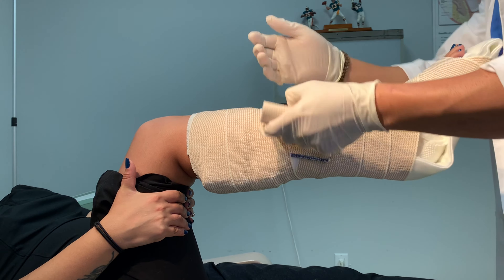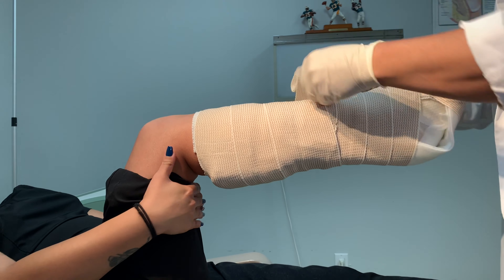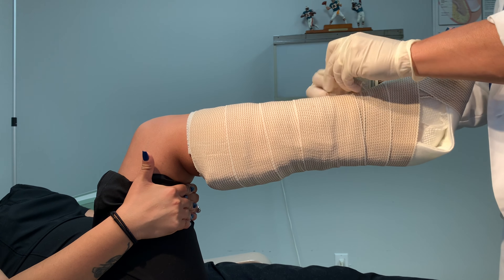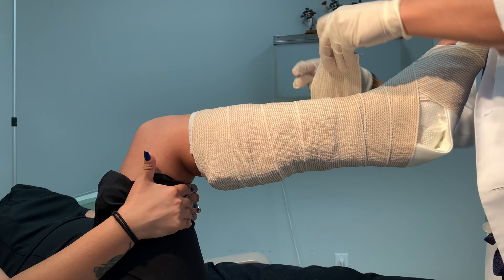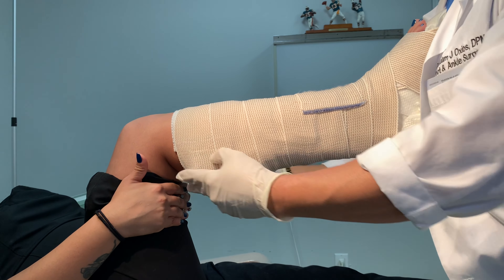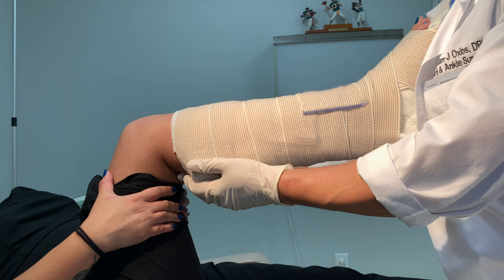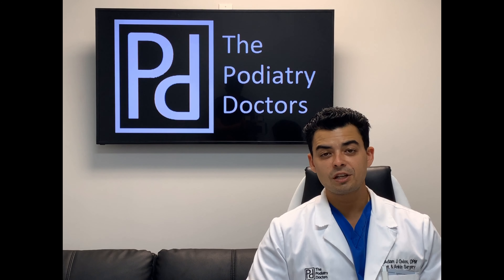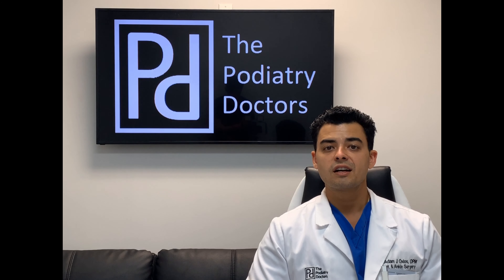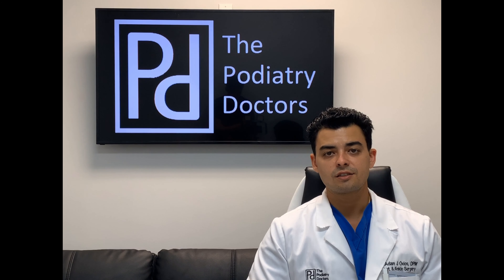The last 4 inch ace is applied from the knee down and completes the splint. While the splint hardens, make sure you continue to help the patient keep their ankle at 90 degrees and in a neutral position. Once hardened, you can go back and cover the heel. Now that your splint material is hardened, go back and recheck your work. If you skipped the heel as instructed, cover it now with the 4 inch ace.